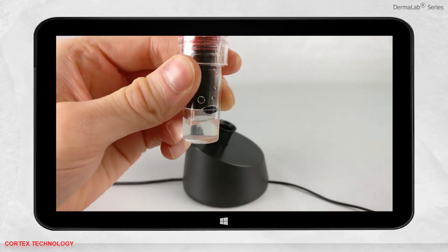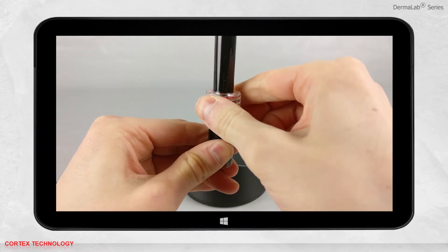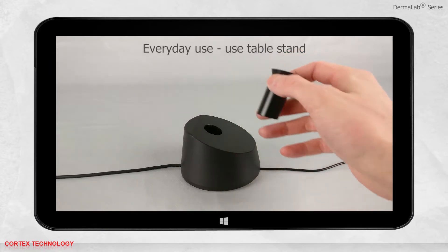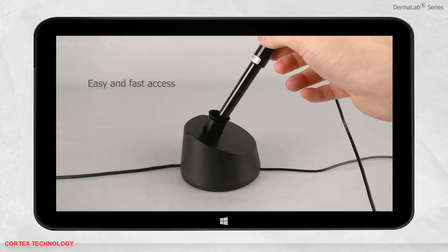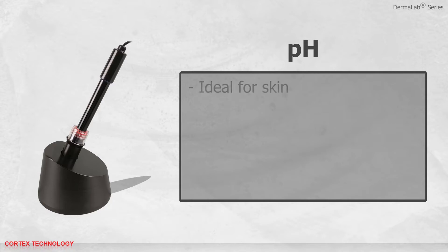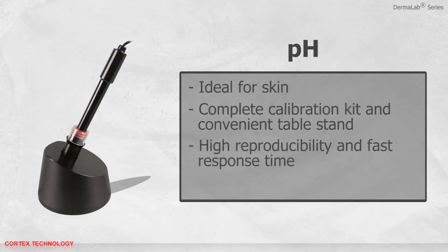It is very important that the probe is all the way down when placing it in the chamber. Remember to tighten the lid and place it back into the table stand. For everyday use, we recommend using the table stand — pour pH storage solution in the chamber until the probe tip is submerged; this gives easy and fast access to the probe. The pH probe features a surface type ideal for skin, comes with a complete calibration kit and a convenient table stand, and offers high reproducibility and fast response time. The Dermalab software facilitates easy calibration.